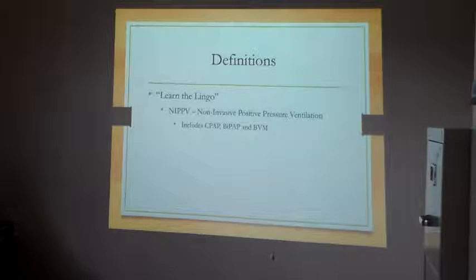So our goal is non-invasive. Remember, once we go invasive, we're worried about what? Infection, okay? That's our biggest problem once we go invasive with any procedure is infection. That's what we want to avoid, okay?